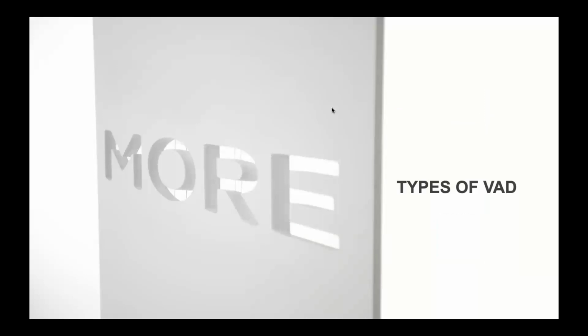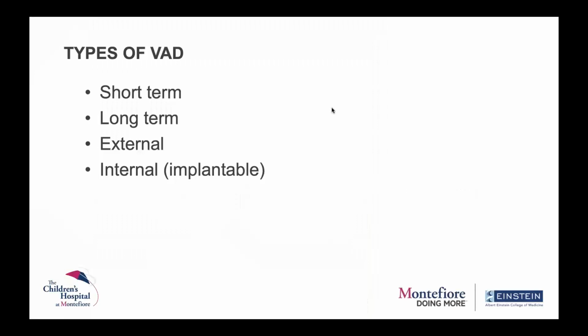What are some types of VADs? So VADs can be short-term, long-term, external, or internal. By external and internal, I mean that external ones can be outside the body, and internal ones are implantable inside the body. And short-term and long-term are kind of self-explanatory. It depends on the duration of support.